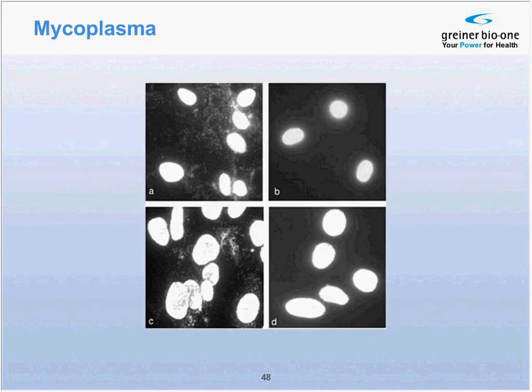Mycoplasma are small prokaryotes that vary in size between 0.2 and 2 micrometers. Thus, they can pass common sterile filters. They grow on the surface of cells, and approximately 30% of all cell lines are estimated to be contaminated. They can impact the cell metabolism, and since they are small in size, they are not as obviously detected as bacteria or fungi.